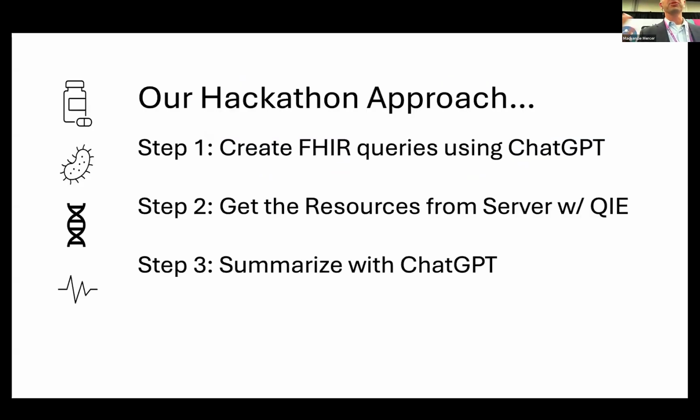So when I heard of this, I thought you could break this problem down into kind of 3 sections. Taking a question from that radiologist, maybe we can construct a FHIR query given a specific server, given a specific patient. Step 2 would be to actually go and retrieve those resources, get that bundle of diagnostic reports or conditions or problems. And then the third would be to summarize it so that it is like a conversation. And we thought we could use ChatGPT to digest that resource bundle down into a conversation that could create that dialogue.